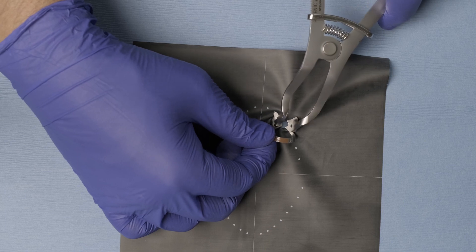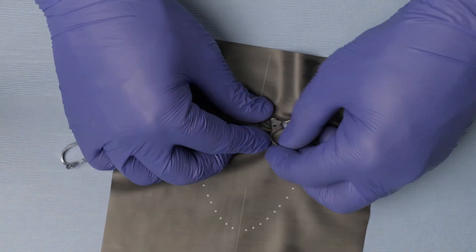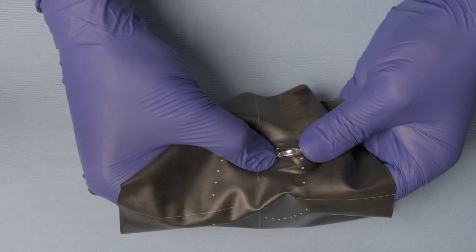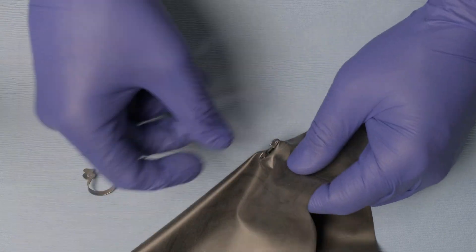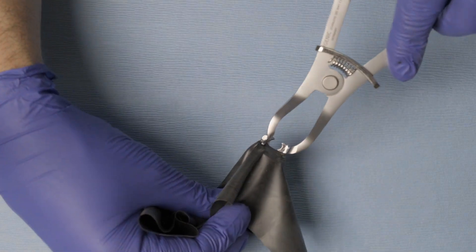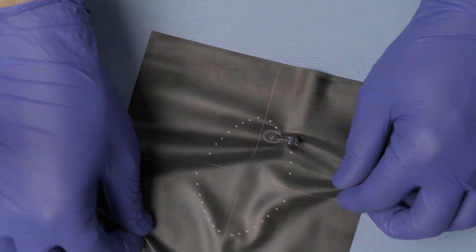Now I can attach my clamp forceps and take this directly into the patient's mouth. The question is, how can I do the same thing with a wingless clamp? Since the clamp does not have any wings, I literally grab the rubber dam and stretch it on top of the bow of the wingless clamp. The jaws of the clamp are underneath the rubber dam. I then connect my forceps, take this into the patient's mouth, connect it to the tooth, let go of the clamp, and stretch the rubber dam around the bow to the cervical portion of the tooth and seal that area completely.